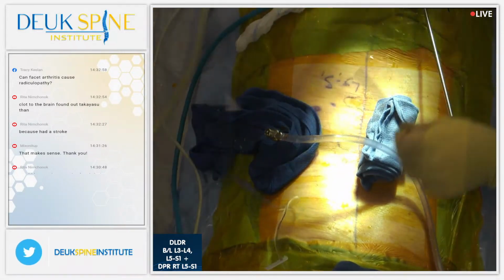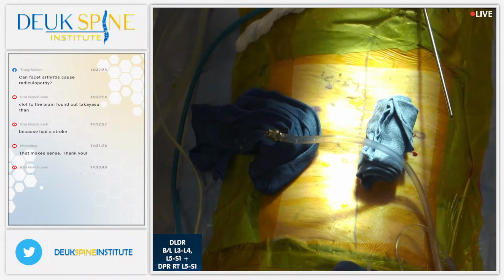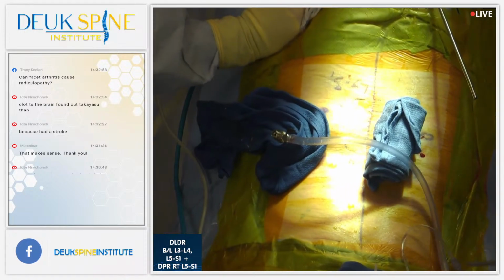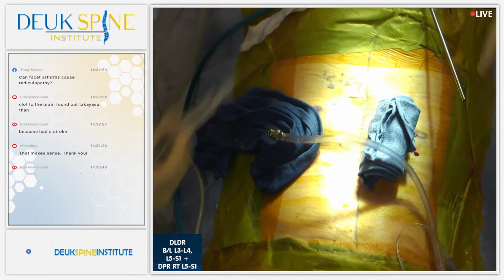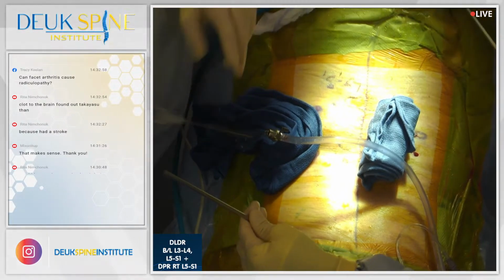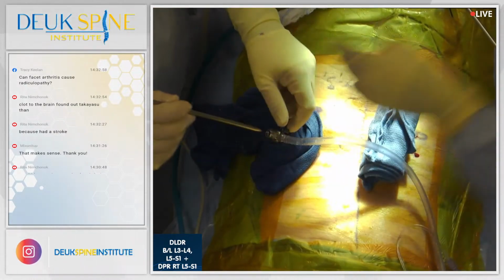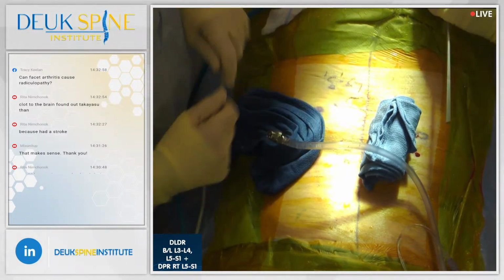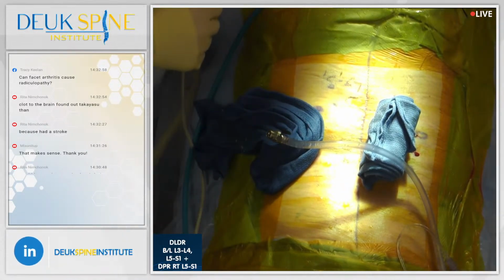Let me get one more irrigation. Scope use is a 7. Can you move this stuff out of here, please? Get all that stuff out of there.